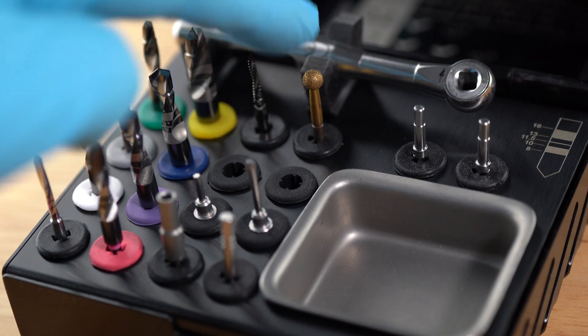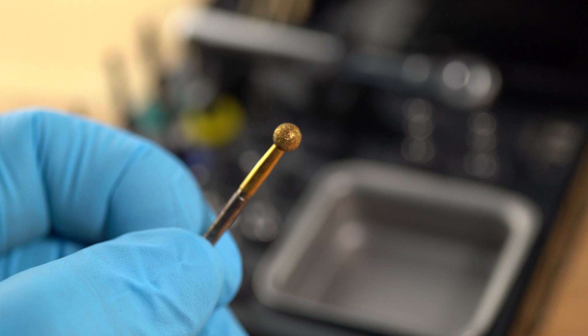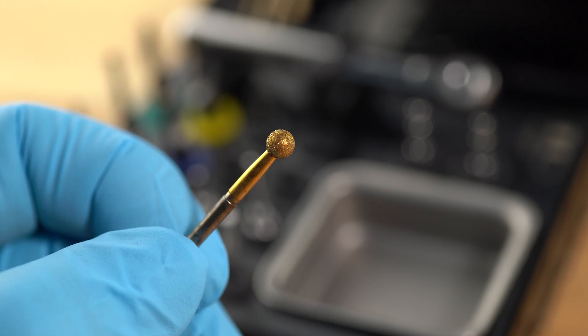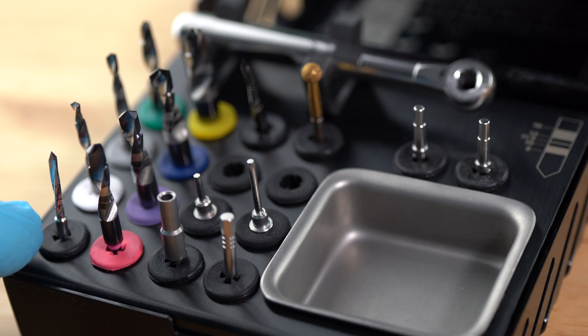The last one to mention is this round burr. While the first two drills are the ones you'll actually start your osteotomy with, you might use this one first just to flatten the bone a little bit. If you have a ridge that is triangular or has any irregularities, you can use this to flatten it up just a little bit.